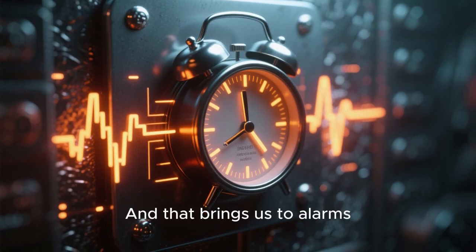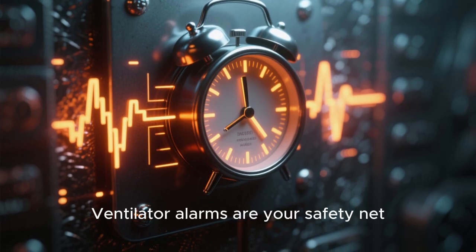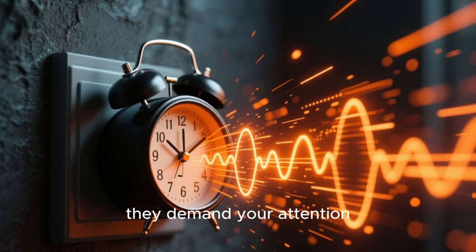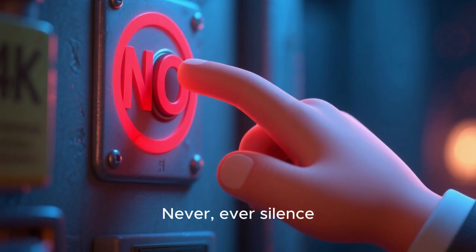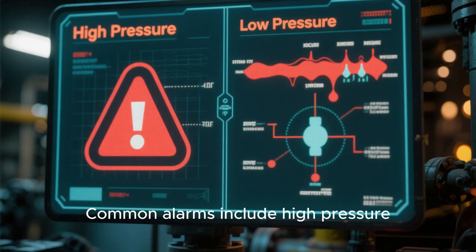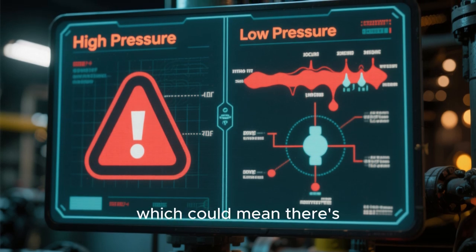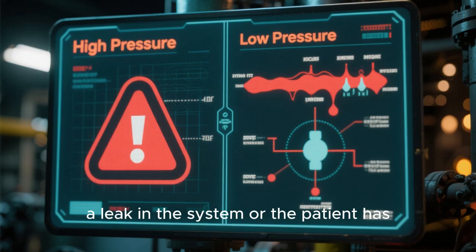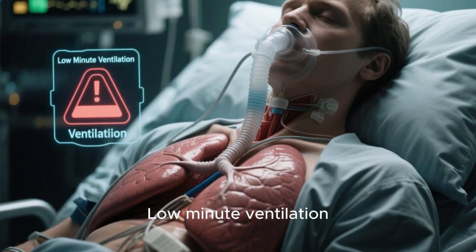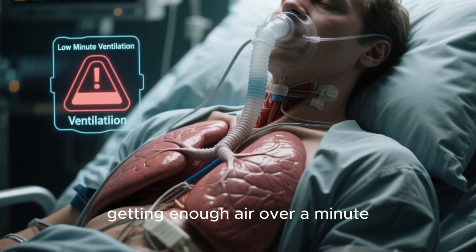And that brings us to alarms. Ventilator alarms are your safety net. They are loud and annoying for a reason. They demand your attention. Never, ever silence an alarm without first figuring out why it's going off. Common alarms include high pressure, which we just discussed, and low pressure, which could mean there's a leak in the system or the patient has disconnected from the ventilator. Low minute ventilation alarms mean the patient isn't getting enough air over a minute.